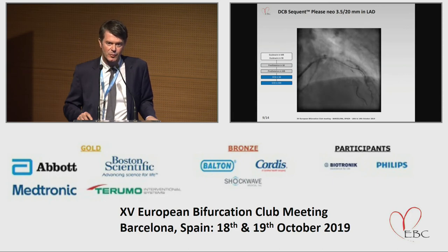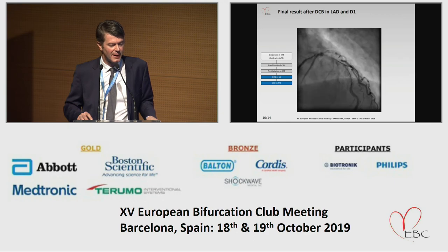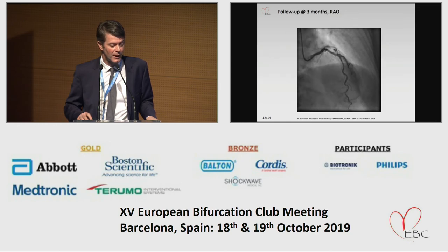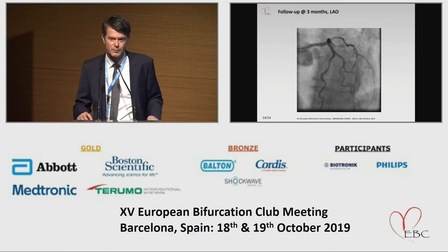This is an acceptable result after DCB only. I left it like this. This is the final result. This is the final result in the lateral view again. And the lady came back. By the way, it was yesterday morning. And this was the long-term result after 3 months. And in the lateral view, it's a perfect result.